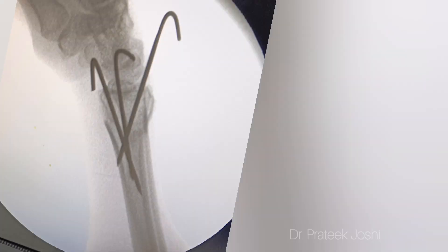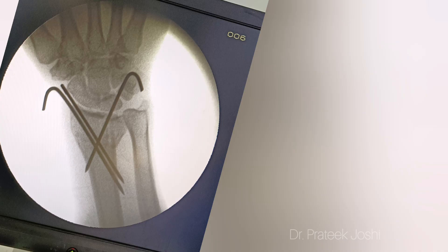These are the images after reduction. We will keep this plaster for six weeks duration, after which we are going to remove the wire and start physiotherapy. Thank you.